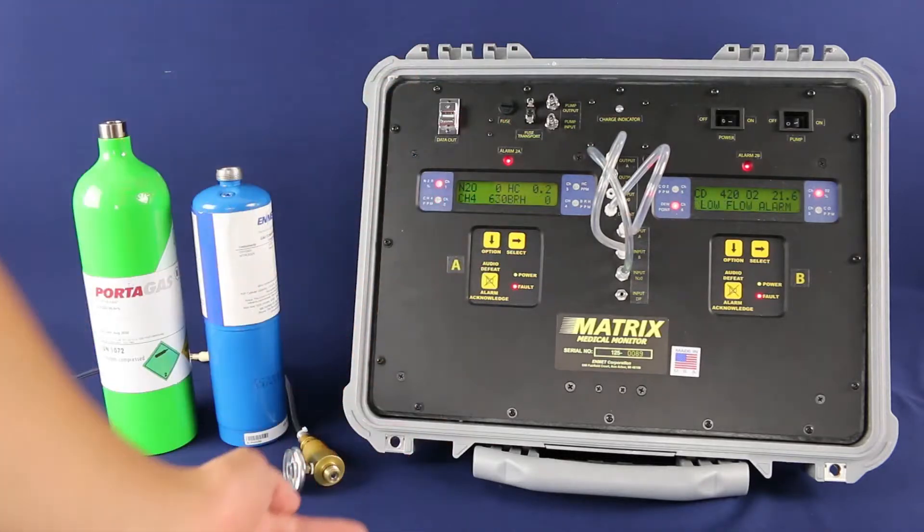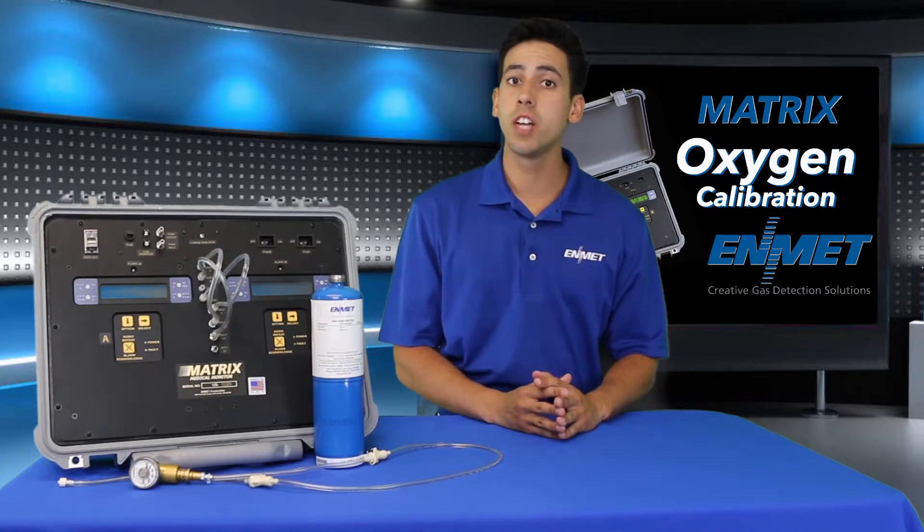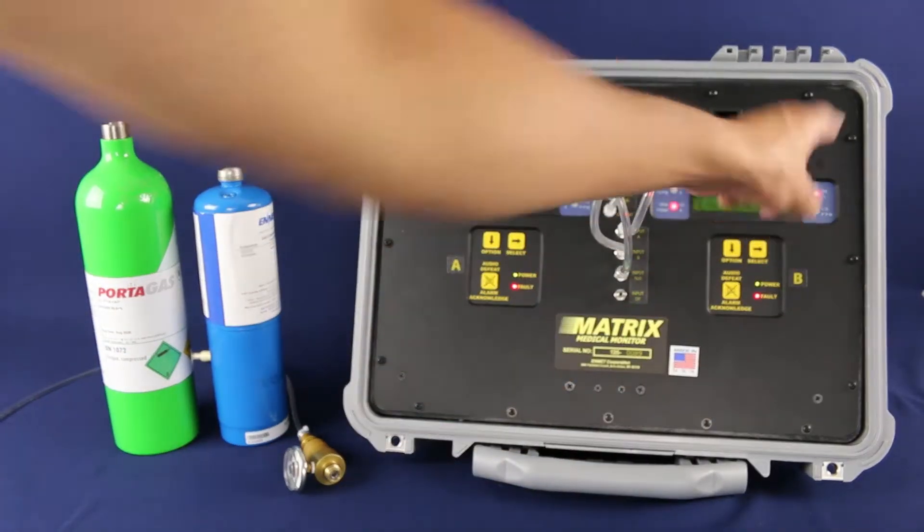If you need help with setting up your matrix for calibration, please see our matrix setup video. Here we have a properly set up matrix unit that we are going to calibrate the oxygen sensor with. The oxygen channel is located on side B, channel 3.